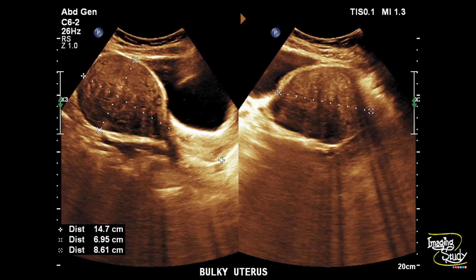Here you can see a bulky uterus — the body looks like a globular shape and the myometrial ecotexture is inhomogeneous. You can see some tiny cystic spaces here also. Let's see on real time.